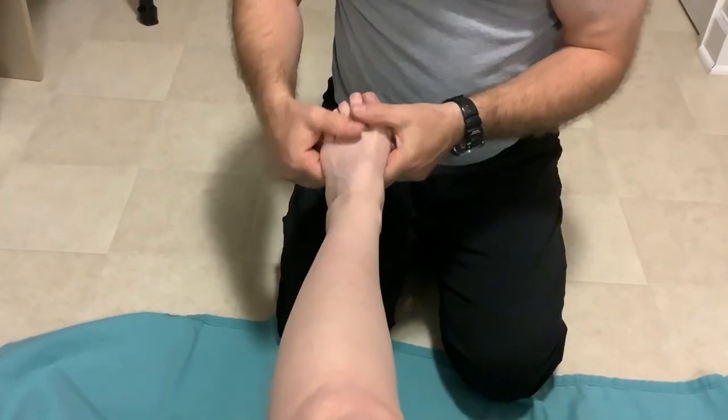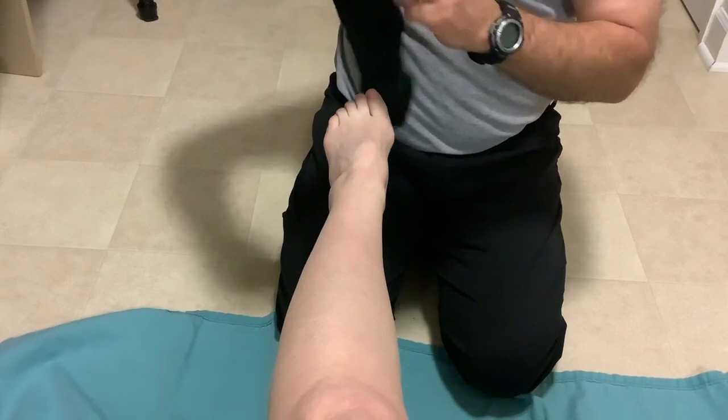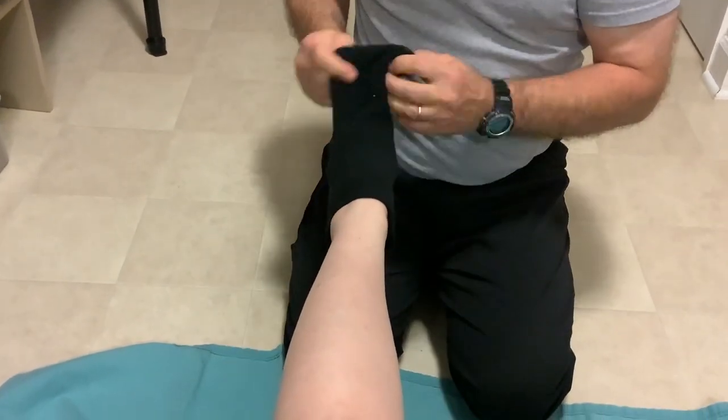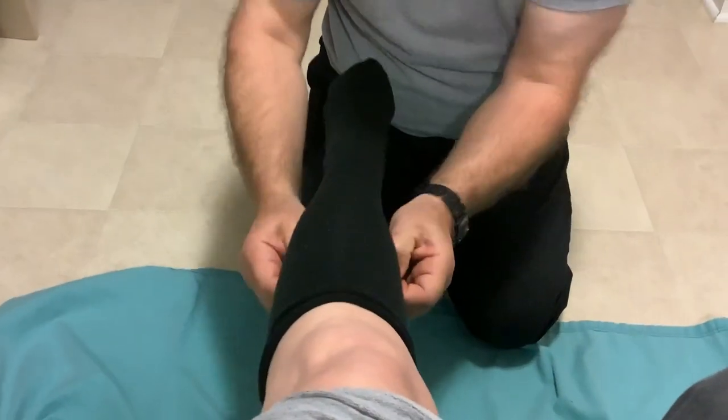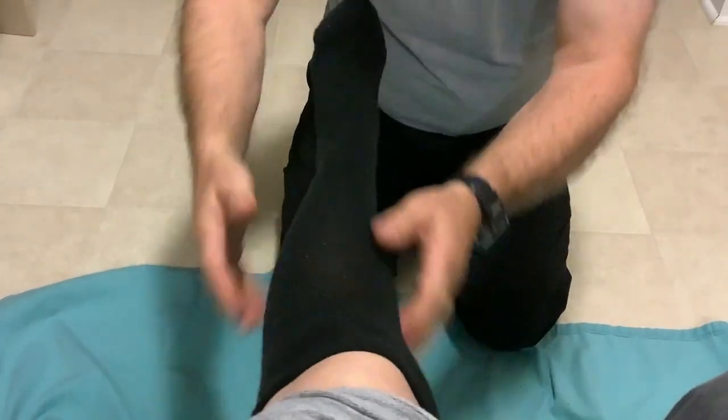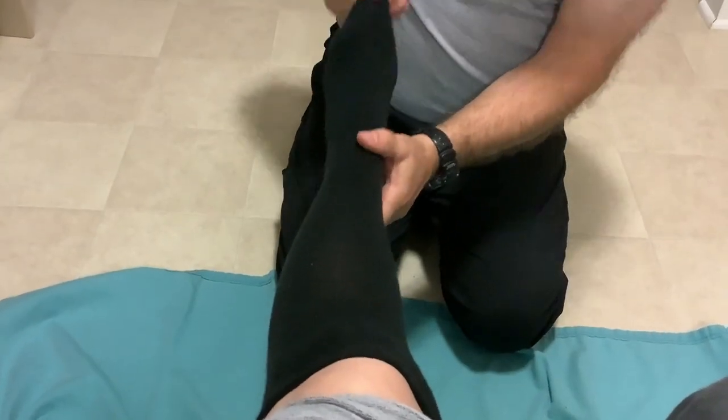Have your patient bring their leg up and point their toes down. Simply stretch the sock wide and slide it right over the foot. Take the rest of the sock and back it up the leg, pulling all the slack up and getting it way above the knee if you can. Give the toe a little bit of a pull.